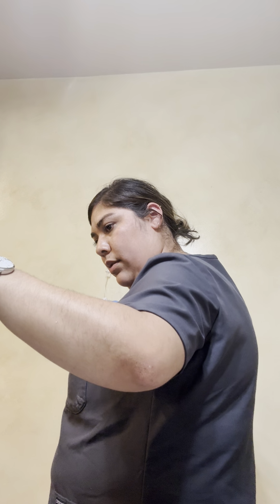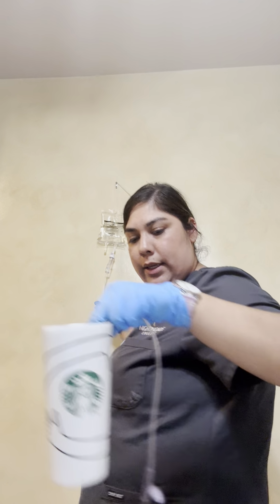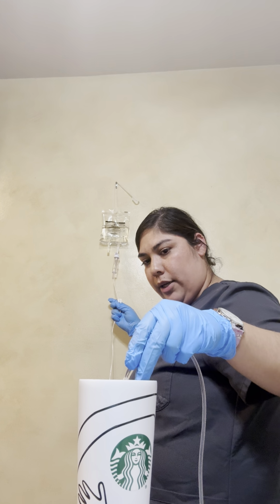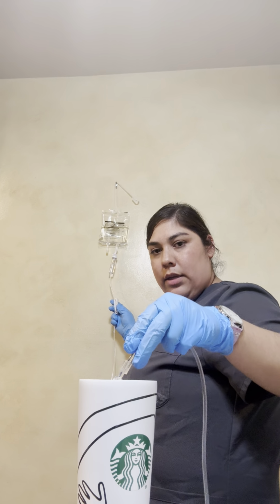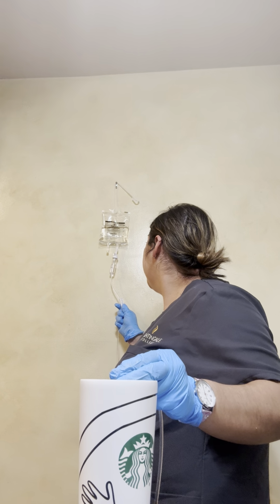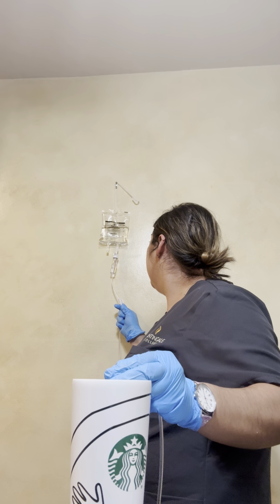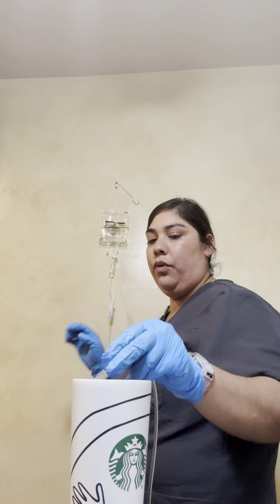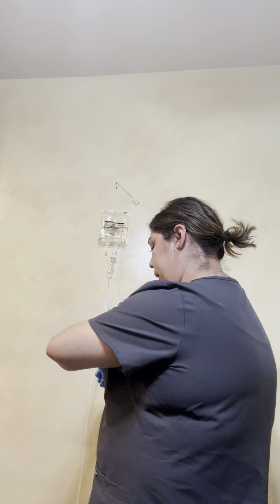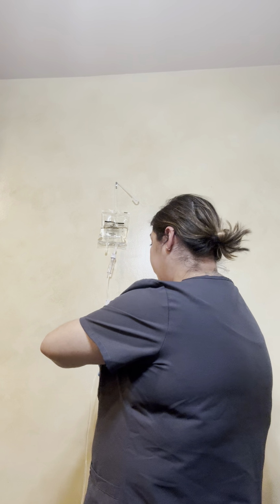There we go. I'm sorry, you can't see. Okay, let's stop. We got you primed. Now that we have that primed, we're gonna go ahead and monitor our drip rate. Let's make sure we set that. And we're gonna be calculating that for a full minute, okay? So I'm gonna put this off to the side, making sure it's not full. Okay. We're gonna go ahead and start now.